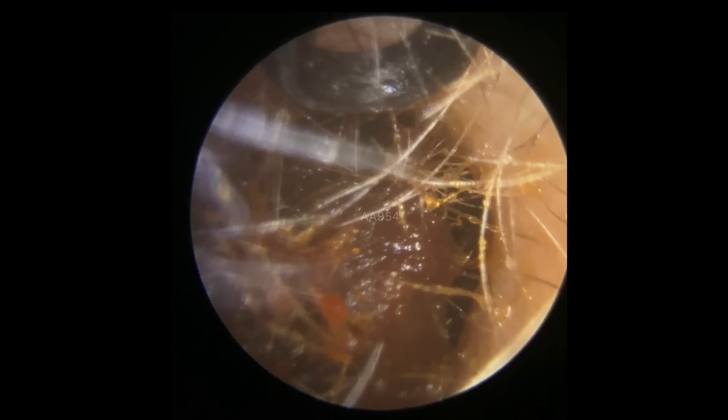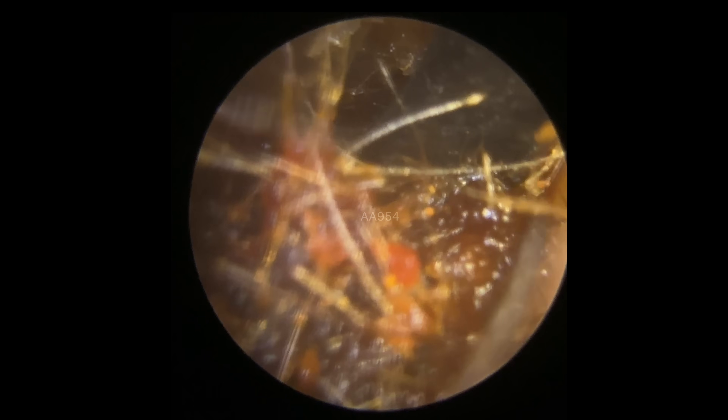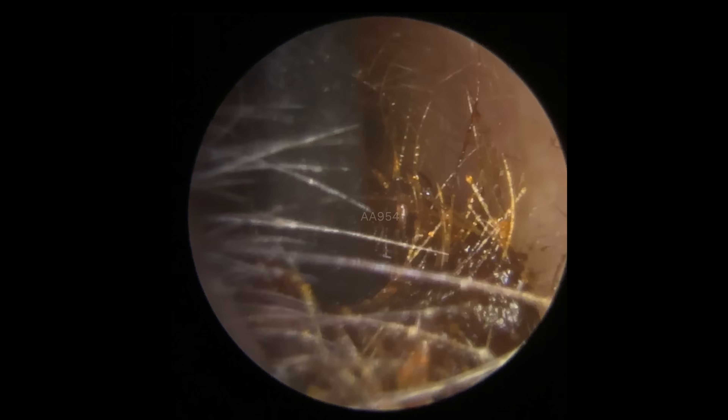We haven't quite got enough suction power to bring this out, so we're going to switch to a manual tool. This is the Jobson horn — this little round ring-shaped tool that we're using here. It's great for these tougher plugs. We've dropped just down behind it and we're going to draw this out. Look at the size of this plug — and bear in mind this is only the first half of it.